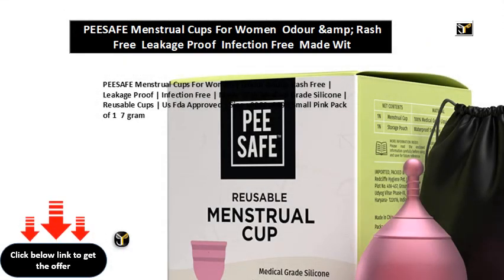Menstrual cups for women — odor and rash free, leakage proof, infection free. Made with medical grade silicone, reusable cups, US FDA approved. Size: U0080, U0093. Small, pink, pack of one, seven grams.